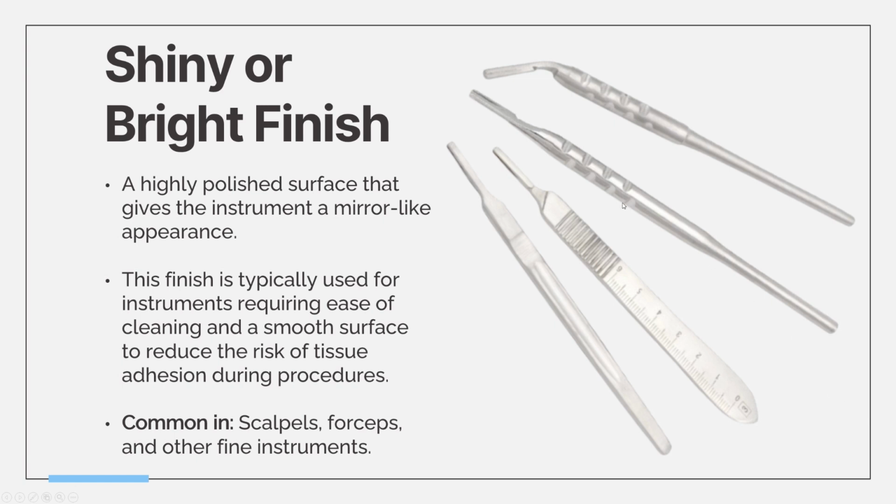And these ones are just very typical scalpels. This one is number 7. Number 3, which I would say is the most common scalpel. It does look similar to a number 4. And these are called Baron, I believe. It's been a while. I'll have to double check. Oh, no, they're a number 5, round scalpel.